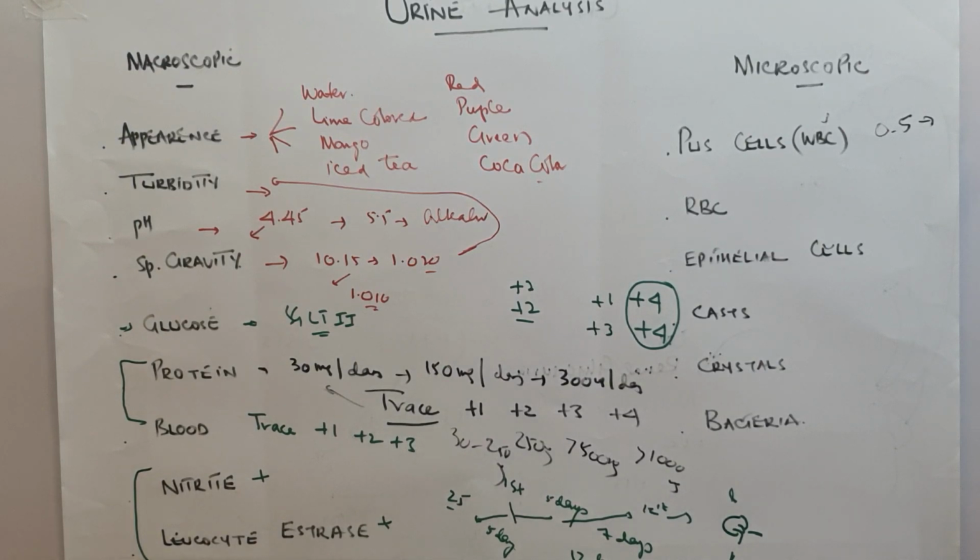doesn't mean much. Quite so often, we see urine examination reports in which we've got like 10 to 20 pus cells, but all the other variables are entirely normal. And unfortunately, even then, these patients are treated for a suspected urinary tract infection. So the pus cells can be present in a lot of conditions. They can be present in infections.